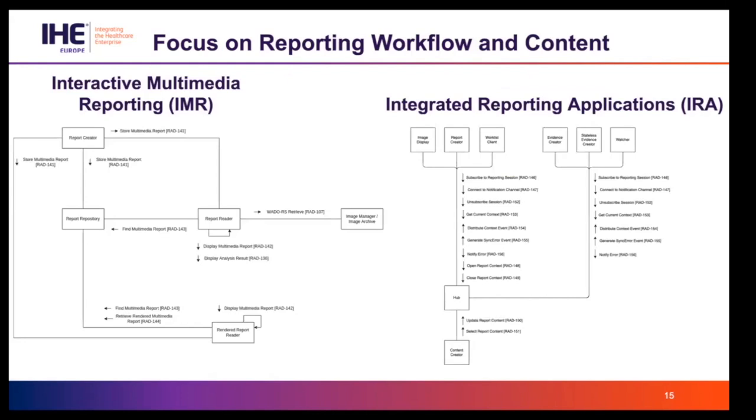The other big area is workflow and content. Again, the profiles that have been in trial implementation for quite a while, exchanging content and context between different applications, creating the links to the multimedia content. Those are part of the reporting paradigm. Next slide.